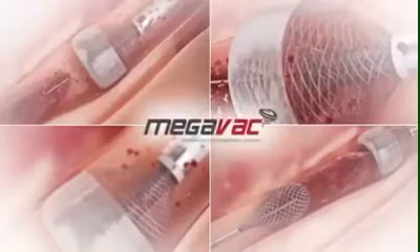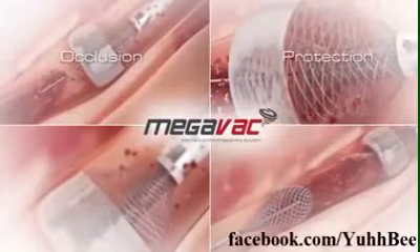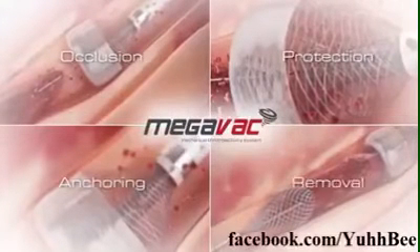Rapid removal of occlusive thrombus with vacuum extraction can accelerate door to balloon time and improve outcomes. Four feature solution in one device: occlusion, protection, anchoring, and removal.